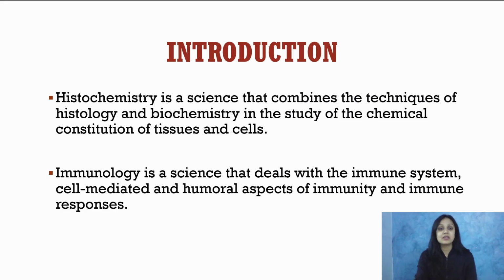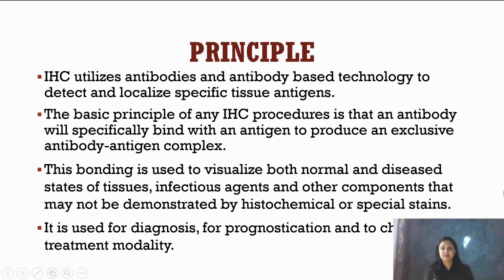Histochemistry is a science which combines the techniques of histology and biochemistry in the study of the chemical constitution of tissues and cells, right? And immunology is a science that deals with the immune system, the cell mediated and humoral aspects of immunity, and immune responses. So, moving on to the principle of it.